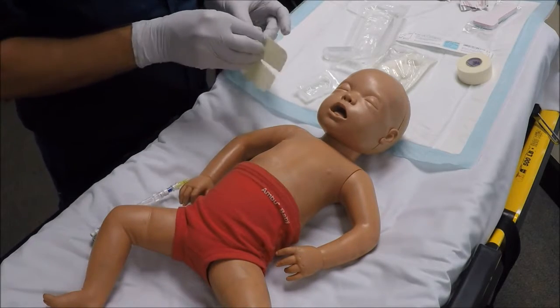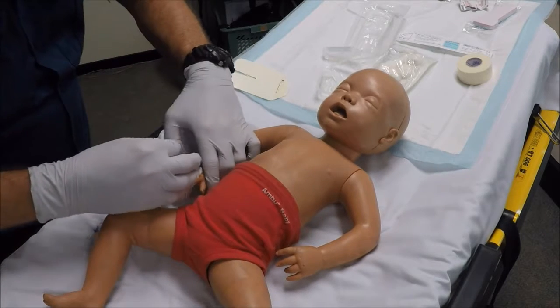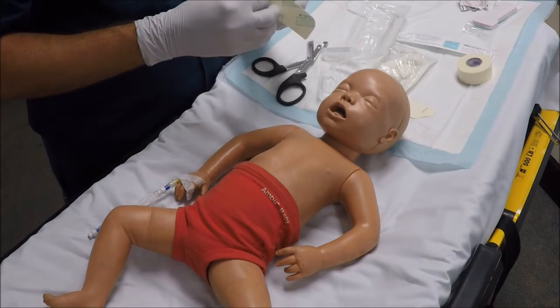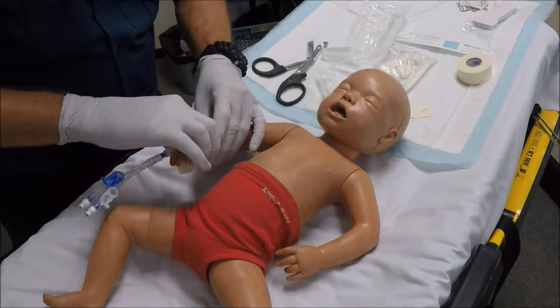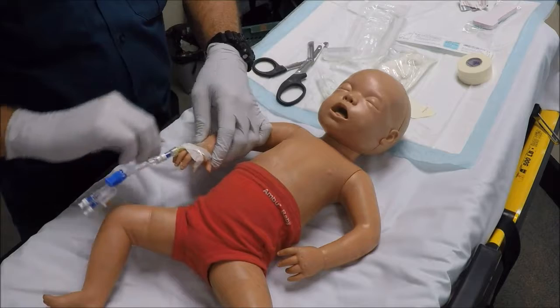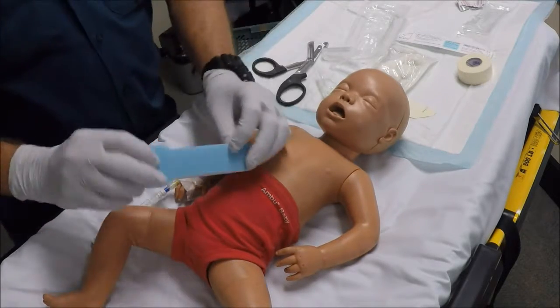With a very small paediatric patient, the standard Opsite dressing may actually be too big for the patient's hands. A tip I picked up from speaking to paediatricians and consultants at receiving hospitals is that you can cut the Opsite in half, place that over the patient's hand, and you still have a clear visible section so you can see the insertion site and look for any signs of extravasation.